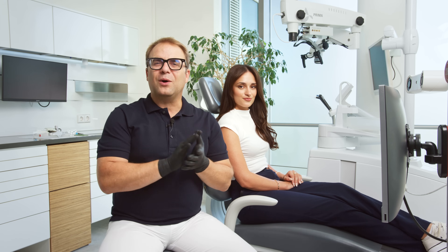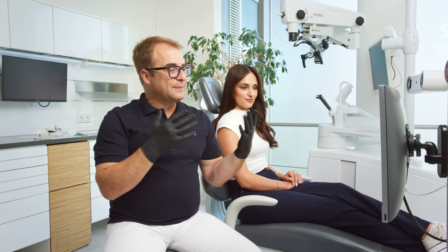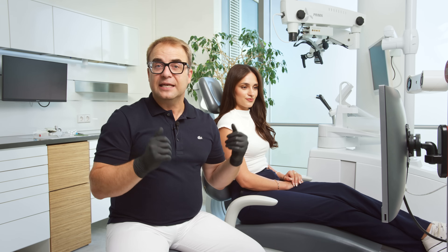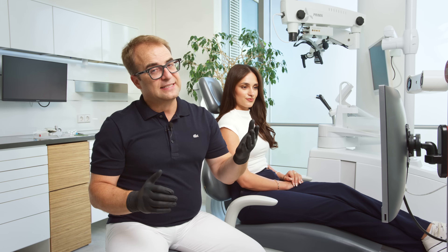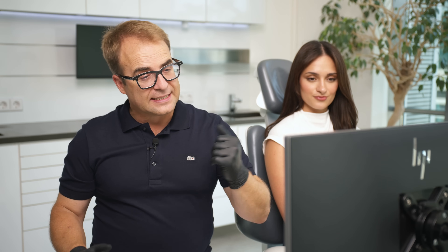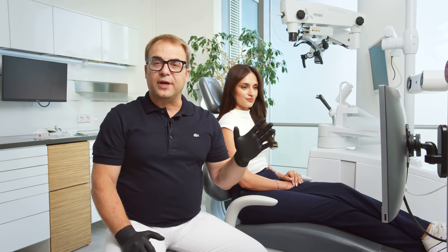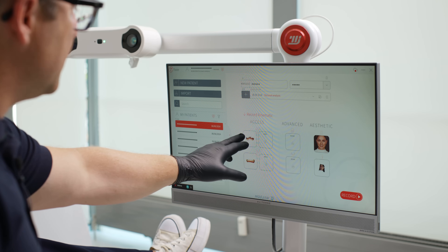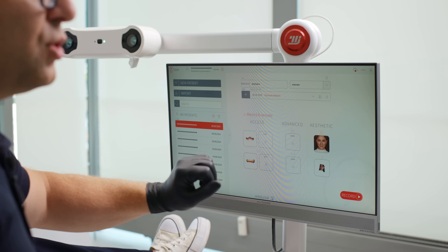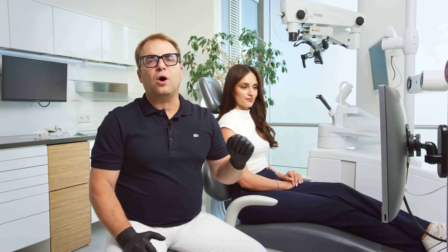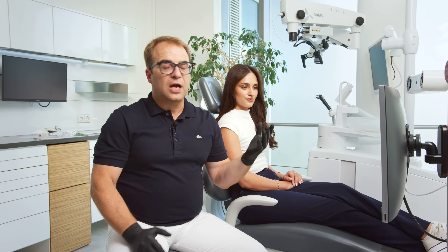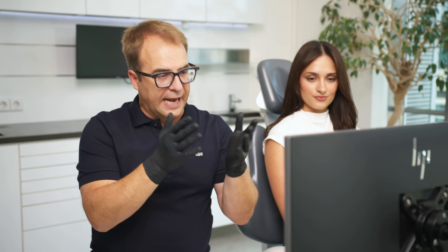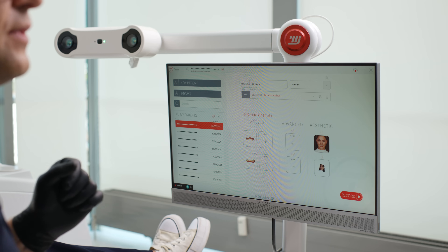Before we launch the jaw motion tracking, let's make sure that you have your patient's 3D intraoral scans. If desired, you can also add a face scan and a CBCT. To start a new recording, upload the 3D models. Select the model of the upper jaw first, then upload the lower jaw. The system will automatically check the occlusion after both models have been uploaded. They must be correctly aligned for an accurate analysis.